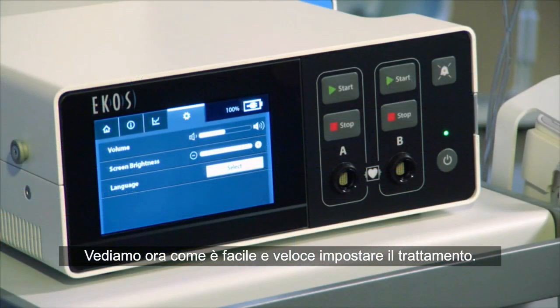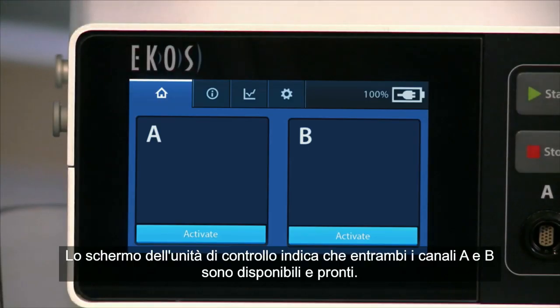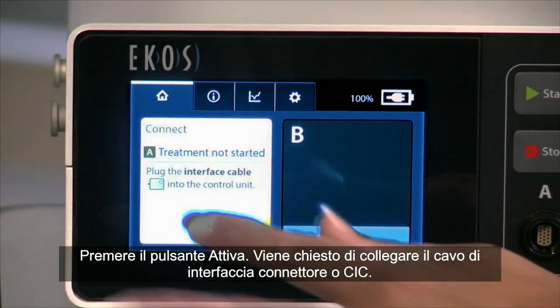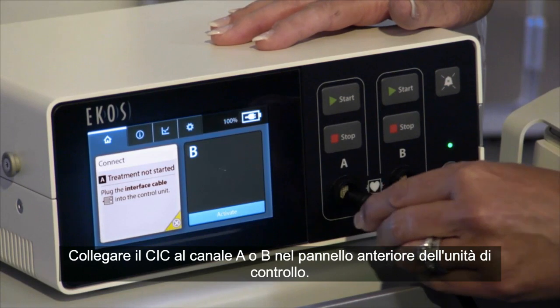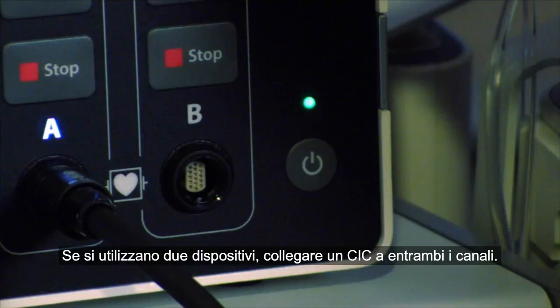Now let's walk through how easy and fast it is to set up treatment. The control unit screen indicates that both channels A and B are available and ready. Press the Activate button. The unit will prompt you to plug in the connector interface cable or CIC. Connect the CIC to channel A or B on the front panel of the control unit. If you are using 2 devices, connect a CIC to each channel.